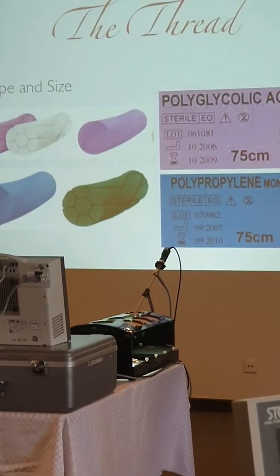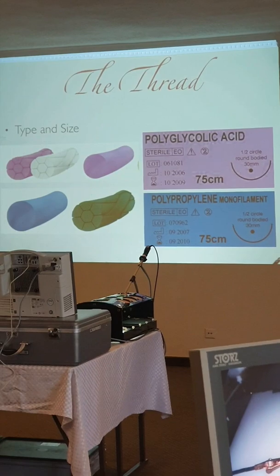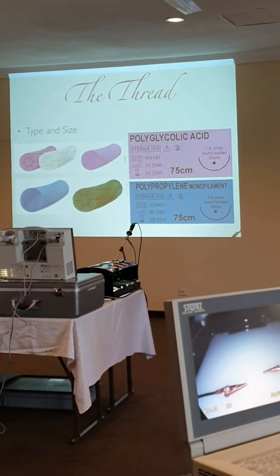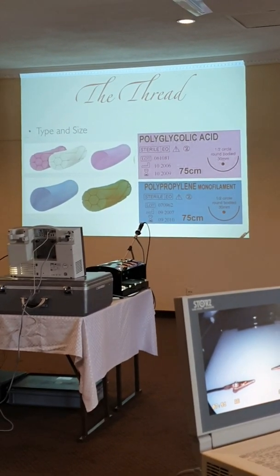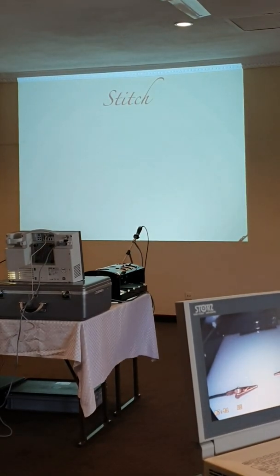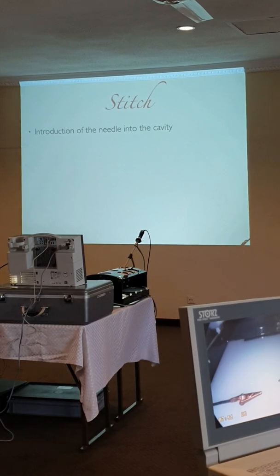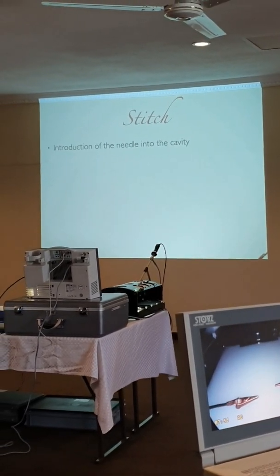More thread, it's okay, but it's more comfortable for you to use in your days. Yeah, but we are using the polyglactin in general use in my days. Yeah, I prefer, it's more comfortable for me. So they teach the introduction of the needle into the cavity. It's very important.